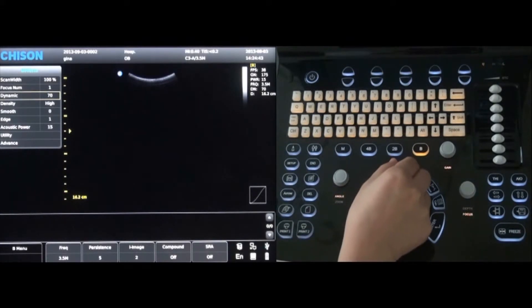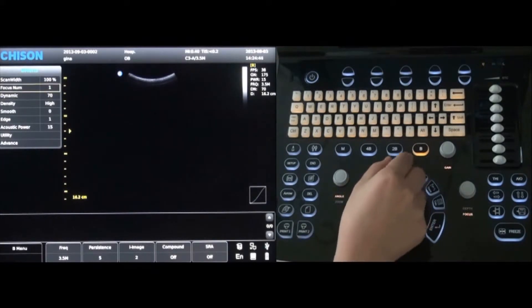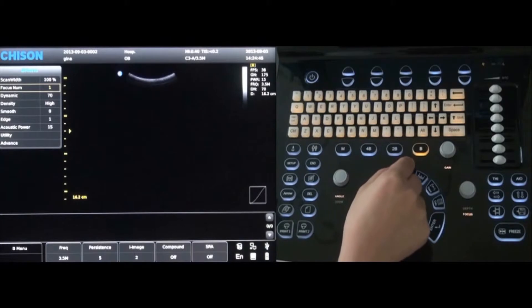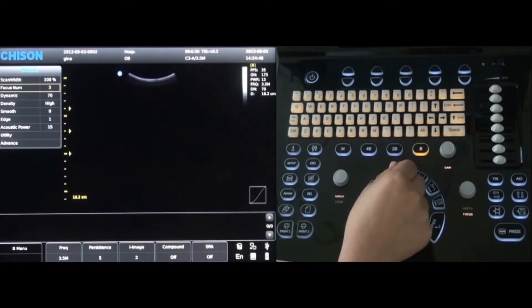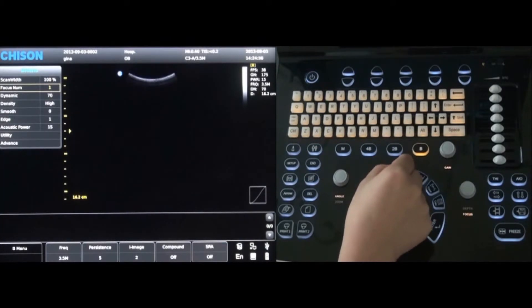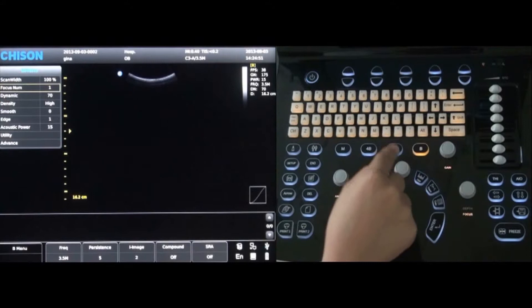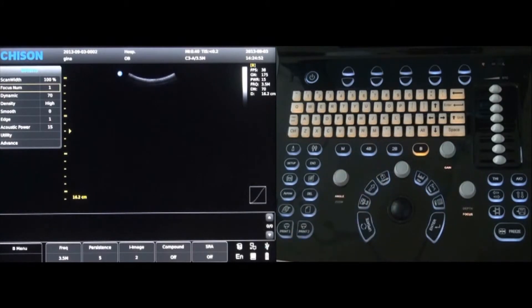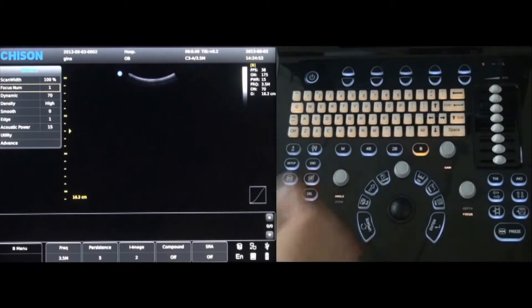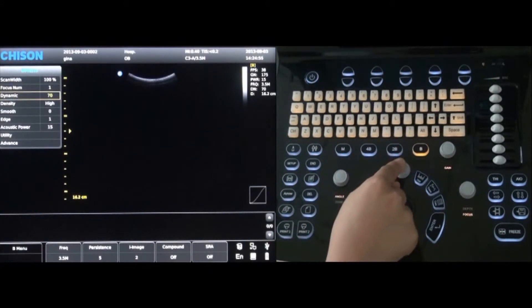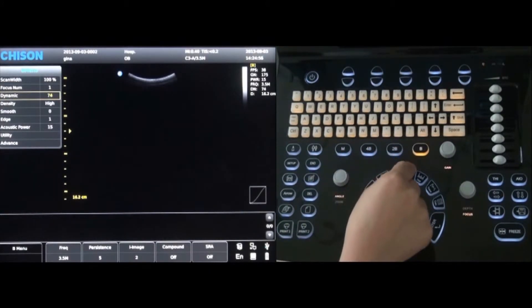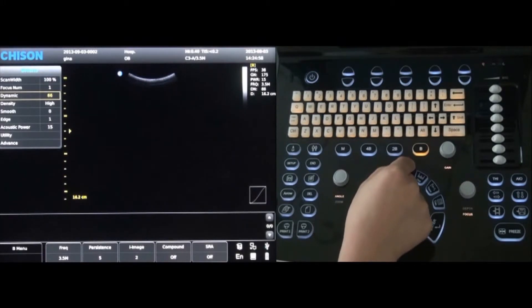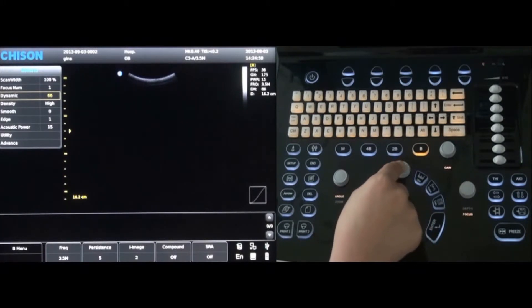Rotate the menu key and select focus number. To make adjustments, simply rotate the menu control knob. Press the menu key again and rotate to dynamic. It can be adjusted up or down once it is selected.